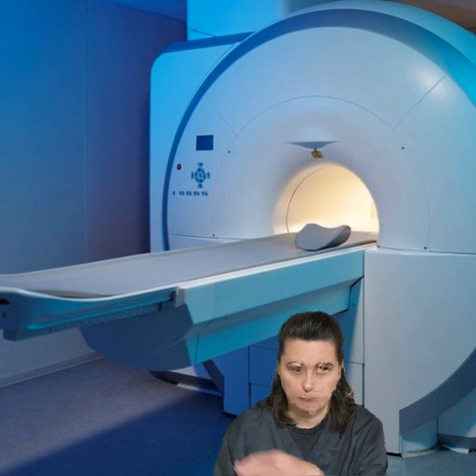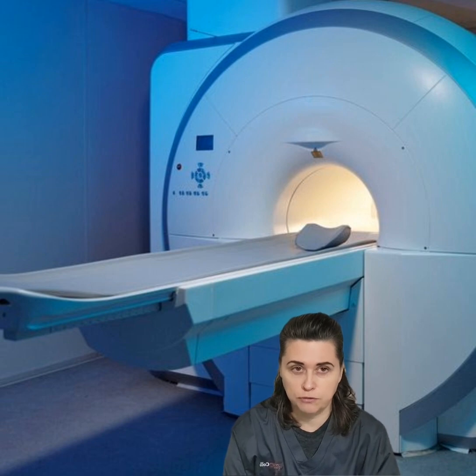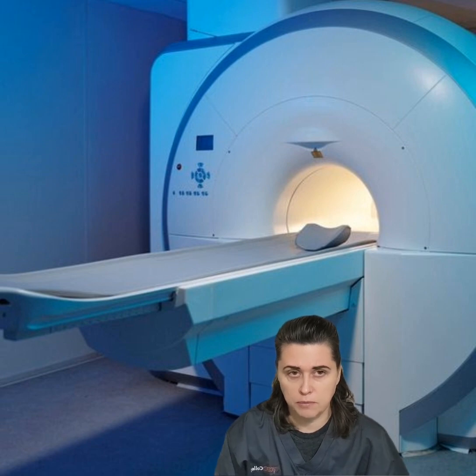There's one tricky thing here. Some people have one extra lumbar vertebra, so instead of 5 it will be 6, and we have to be careful counting it right. We should locate the ribs, and this way we'll see where the thoracic vertebrae are, and then where the lumbar vertebrae are.